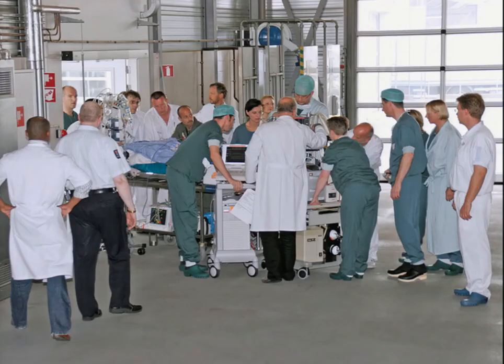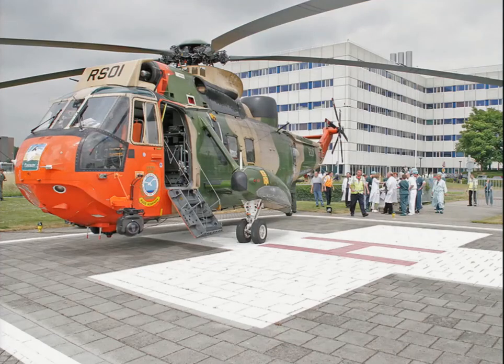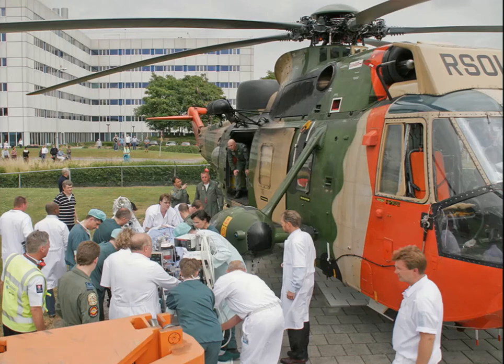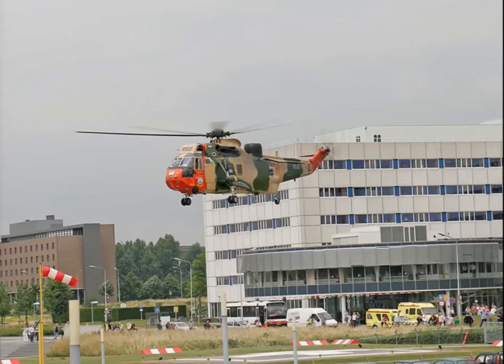So we go outside, and you can now see what the transport medium is. It's a helicopter from the Belgian Marine. And the patient was actually lifted with a forklift truck into the helicopter. So you see that the extracorporeal support is somewhat a bystander, as you can see here. And we achieved this, and ultimately the patient was successfully transplanted and returned to the hospital as an employee. So that was really a great success for one individual.